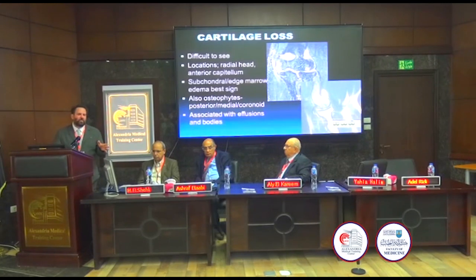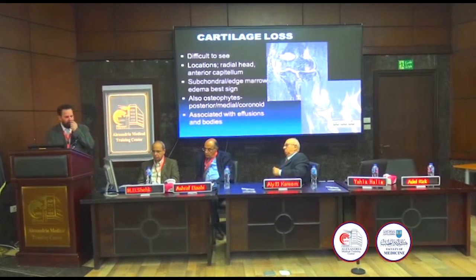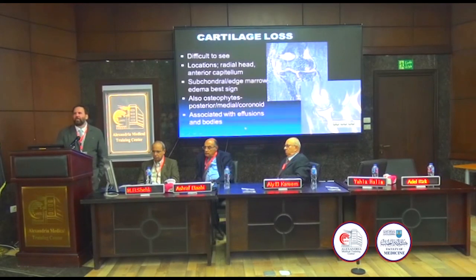So cartilage loss is the most common reason to have a joint effusion. That joint effusion is going to be clean, homogeneous, with no visible synovium. And it's going to occur in 2 places, the anterior aspect of the capitellum and the radial head.